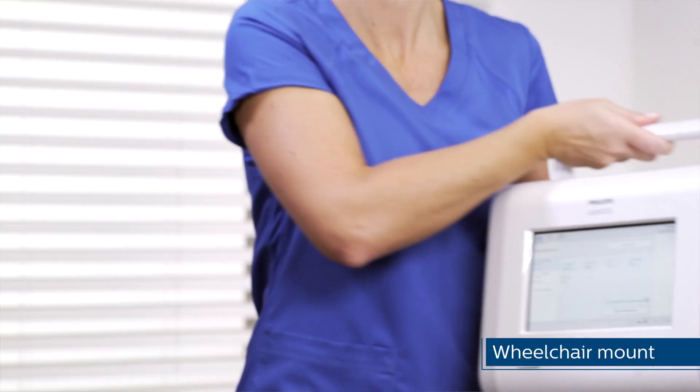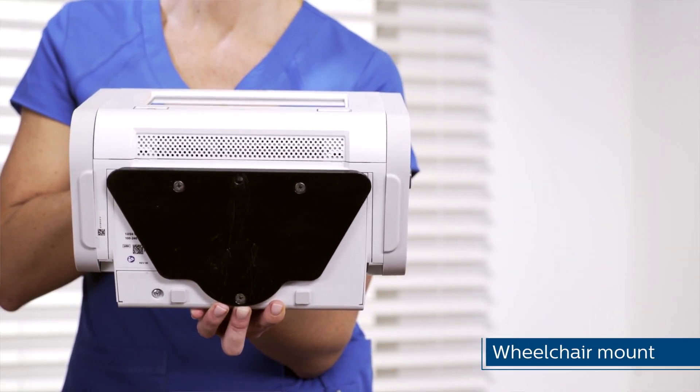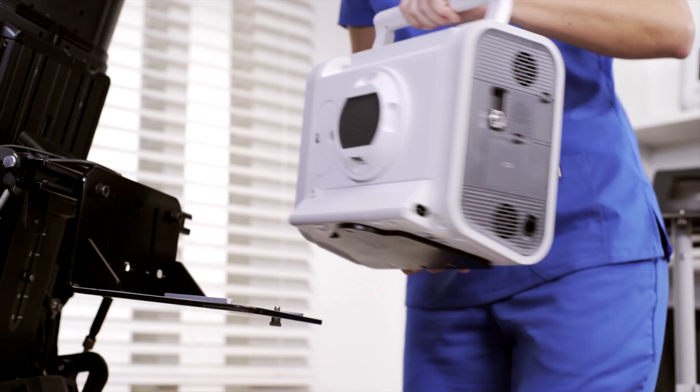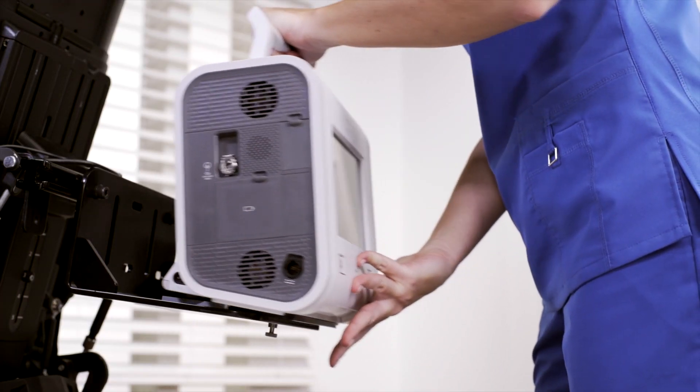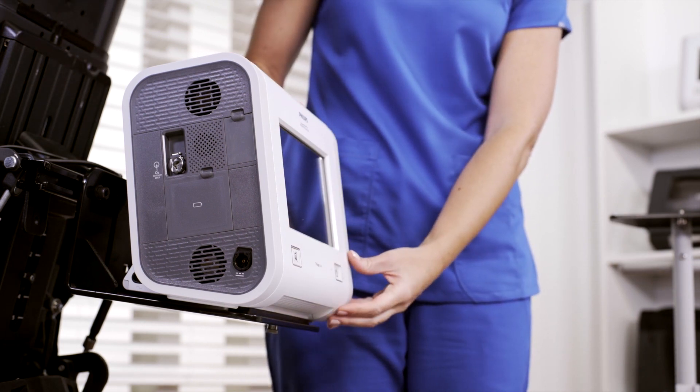For patient mobility, the device can be easily and securely attached to a wheelchair using the same attachment plate as the roll stand. These and other accessories make Trilogy EVO versatile and convenient for clinical use.